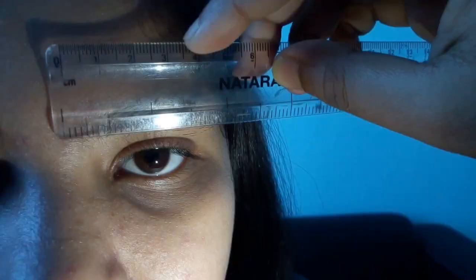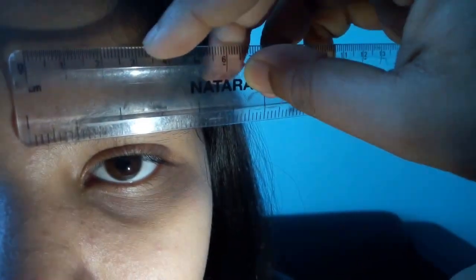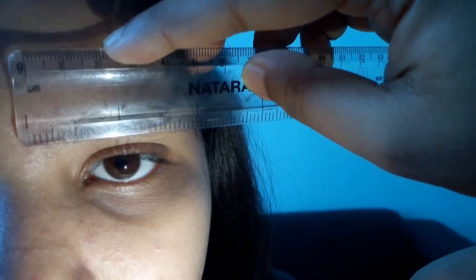The examiner and patient are positioned one hand distance apart. Now, the examiner holds a pen torch below her right eye and measures the patient's left eye pupillary distance.